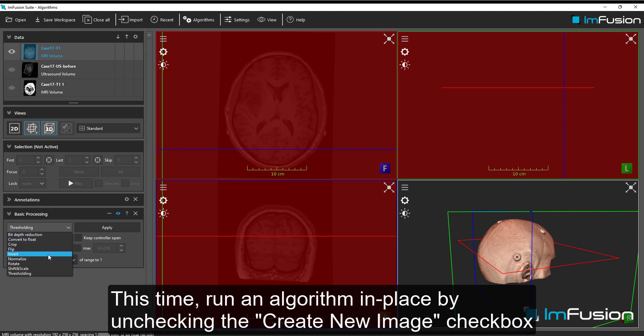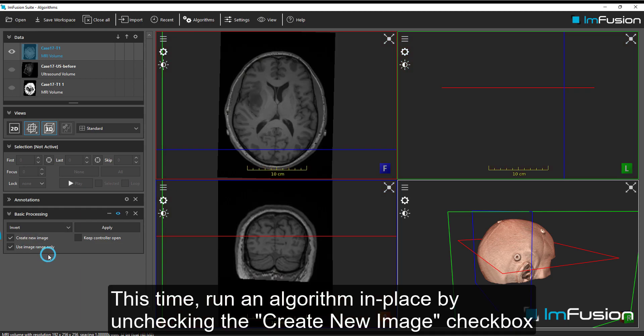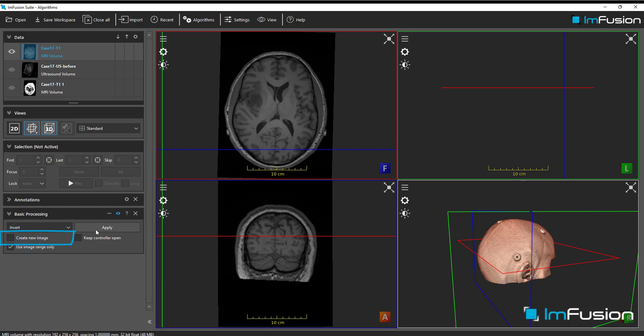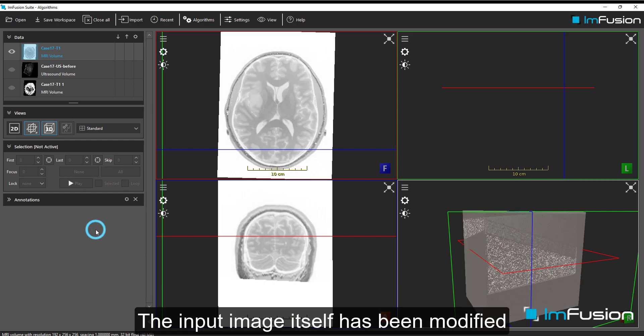This time, run an algorithm in place by unchecking the Create New Image checkbox. The input image itself has been modified.